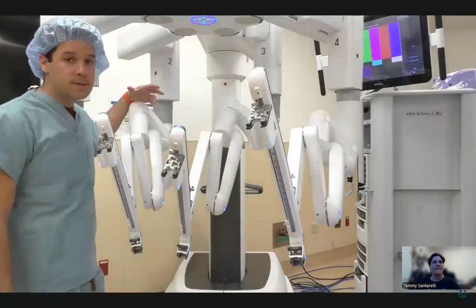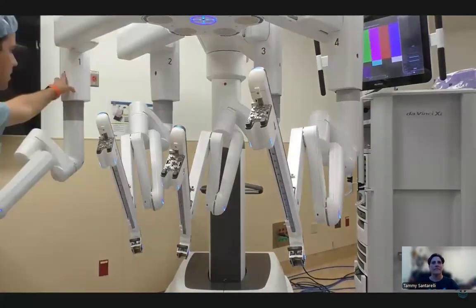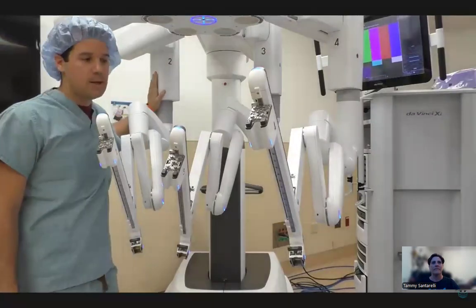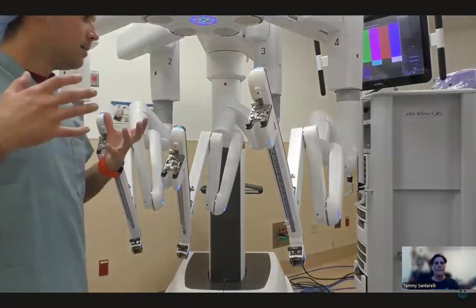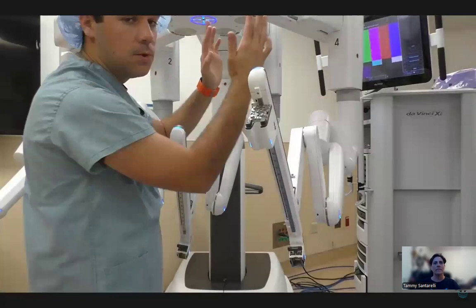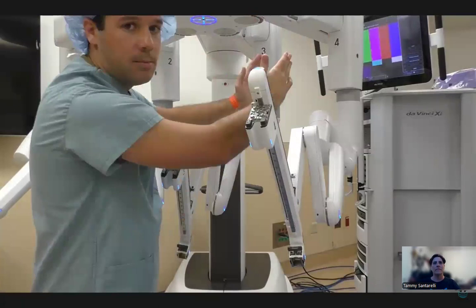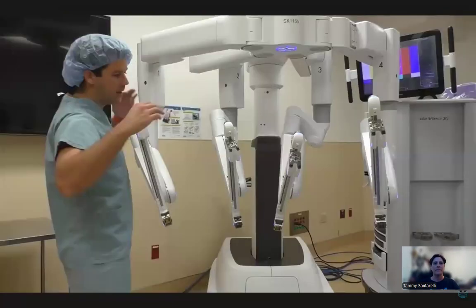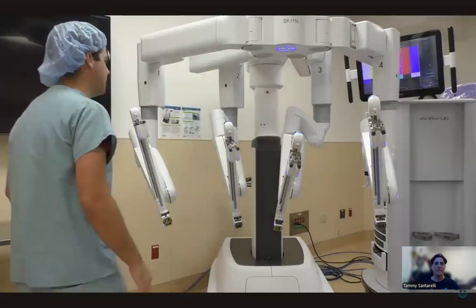Now, I don't know if you've noticed these yet, but there's a whole bunch of weird little red dots up on the top of these arms. These are actually magnets, and these are for draping purposes. The drape that we're going to be using is basically a big clear plastic drape. It's going to go over the arm, all the way up the arm, and there's two little magnets that you're holding onto underneath the drape that you just snap in place on each of these magnet holes here. So when looking at this robot, you would think you have 1, 2, 3, 4 drapes that you need to drape with. That's not the case.